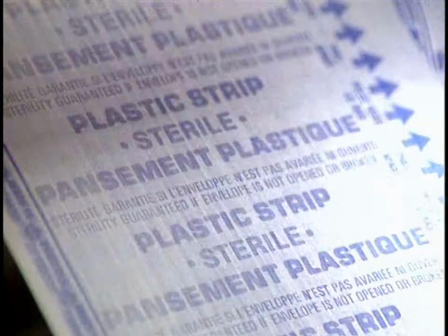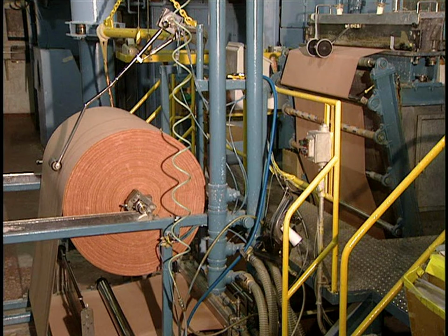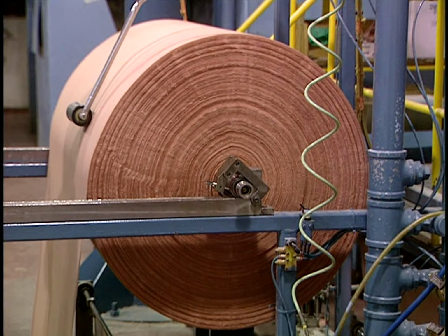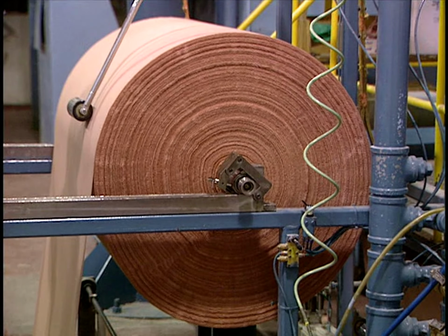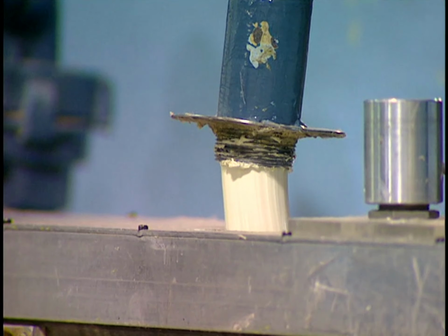Adhesive bandages are made of various materials, among which is the main support called ETS, a fabric that's elastic in only one direction. It's a fabric that will become the adhesive portion of the bandage. This 6,000-foot roll of fabric can make 1,800,000 small bandages, or 300,000 large bandages.